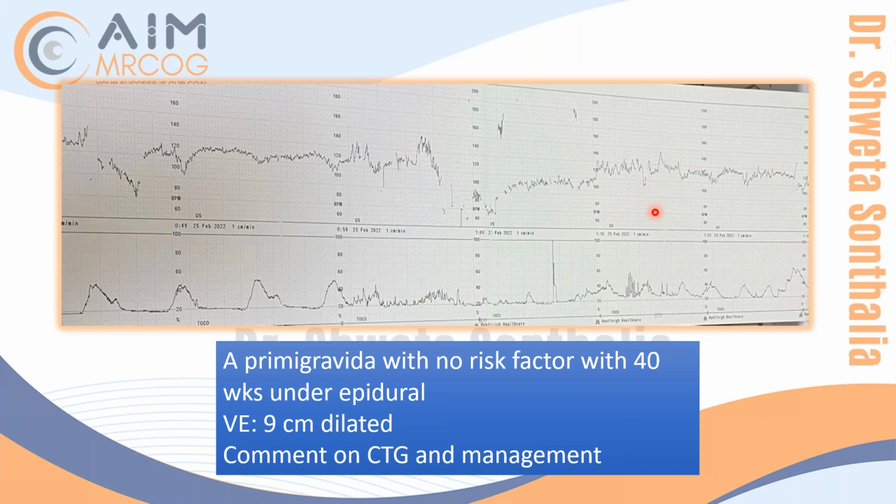In the initial 30 minutes, after two boxes there is a deep deceleration. This one is a deep deceleration. Could be loss of contact. Very good. What else? But the baseline is less here, 100.